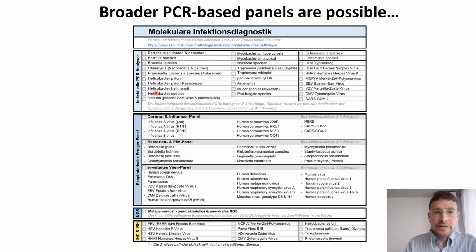For example, this is a reference laboratory of infectious pathology in Switzerland, in Liestal, and as you can see here, you can choose from different PCR-specific bacterial analyses, or you can also order a panel. For example, if you have a respiratory infection, a lung specimen, formalin-fixed, paraffin-embedded, it works as well, and you have an amplification of DNA through primers for all these genes. So you may have your answer if you don't know which microorganism you are dealing with.